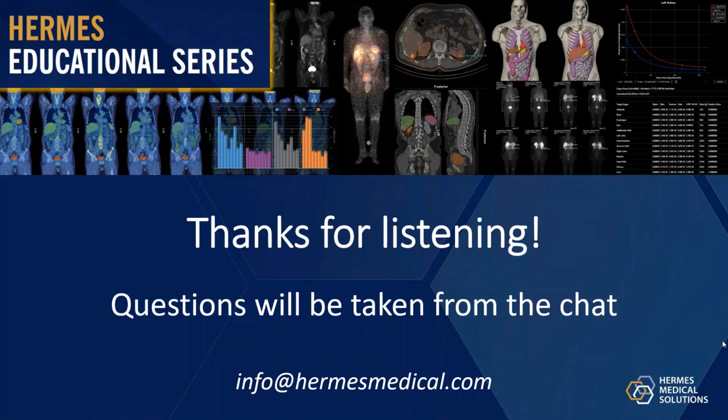But for OSEM hybrid recon, we have the three-dimensional Gaussian filtering available, and then we have the frequency space filter, the Butterworth filter, available. But I would recommend using the three-dimensional Gaussian filter, which will give you results that are maybe a bit better than with the frequency-based filters.